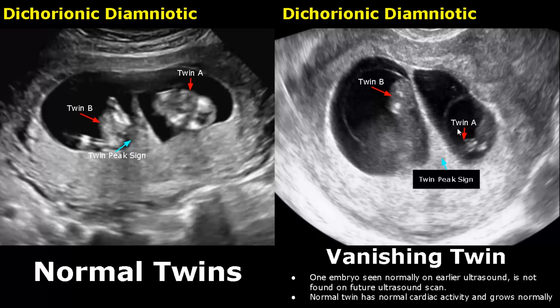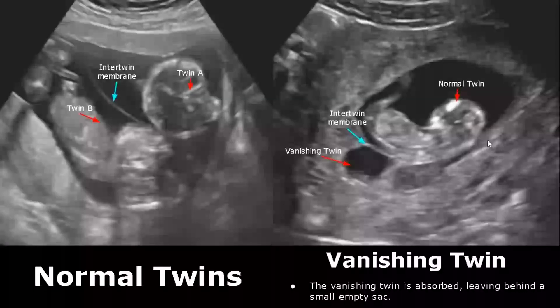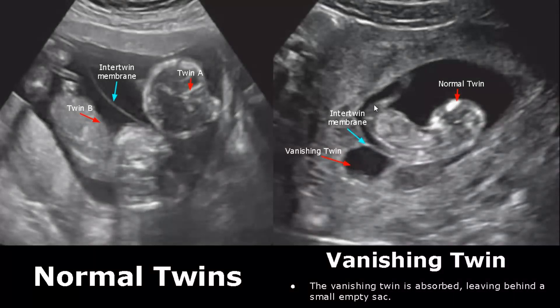Vanishing twin occurs when an embryo seen normally on an earlier ultrasound disappears on a future scan. The other twin has normal cardiac activity and grows normally. The vanishing twin will be smaller in size and will have no heartbeat. In this image we see a small, empty sac. The vanishing twin is ultimately absorbed and only one normally growing twin is left behind.